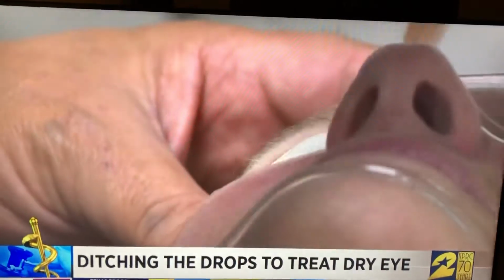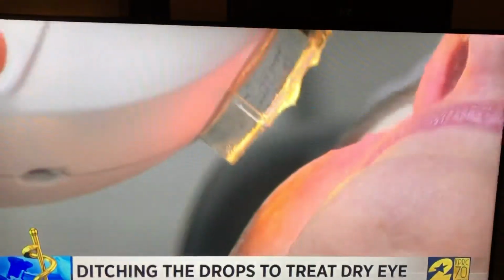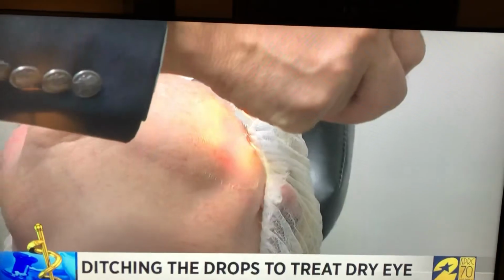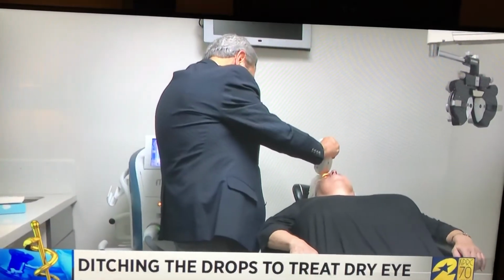Here's how it works. First, a clear gel is spread across the cheeks. Then Dr. Panzer uses the wand to shoot rays of the intense pulse light into the skin, pausing after each time. Dr. Panzer says the IPL is scattered across the patient's face while their eyes are covered. The heat in the skin actually spreads to the eyes, shrinking the tiny blood vessels.